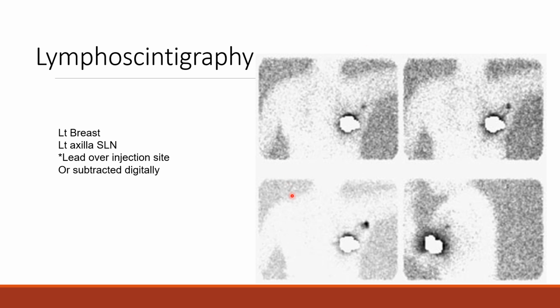A lot of times to do a transmission image, you can just hold your normal cobalt sheet source that you use for a flood between the patient, behind the patient and the camera. So you have like camera, patient, and then the source, right? You're putting your patient between the flood source and the camera to purposely attenuate your flood source so it creates this outline of the body. So you don't hold it there for very long. Just like a couple seconds is all you need just to create enough of a contrast that you can see where you're actually looking at.